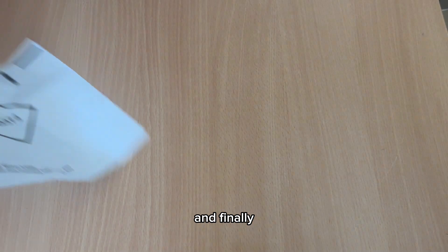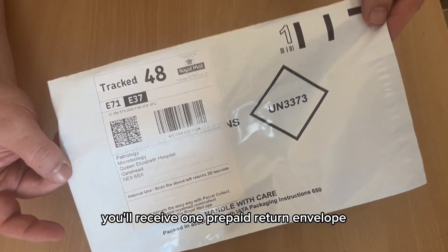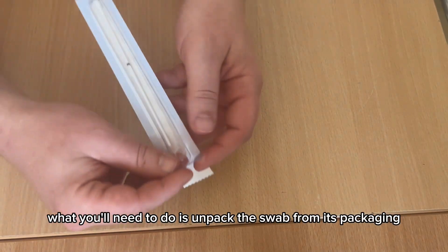Finally, you'll receive one prepaid return envelope, so there's no need for stamps. What you'll need to do is unpack the swab from its packaging.